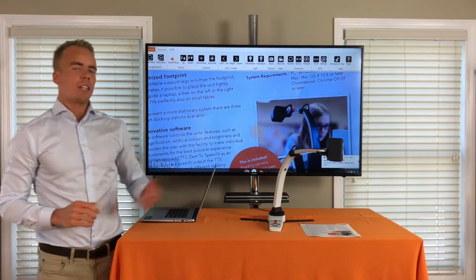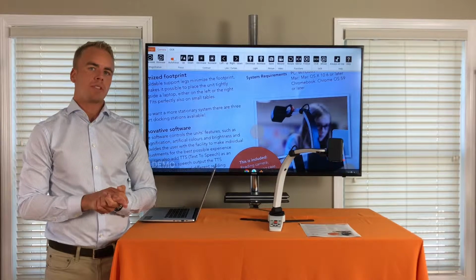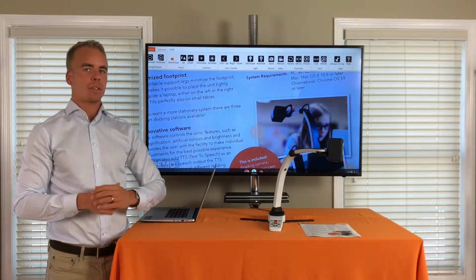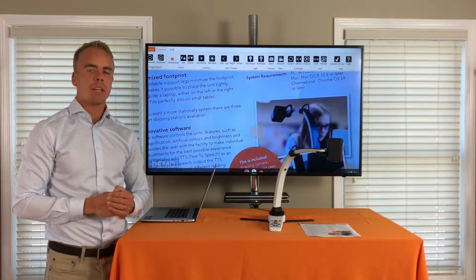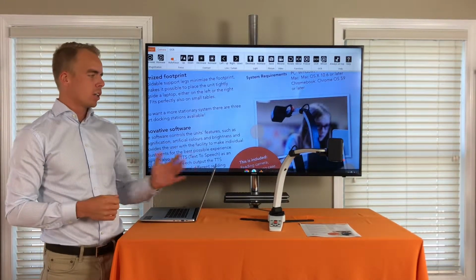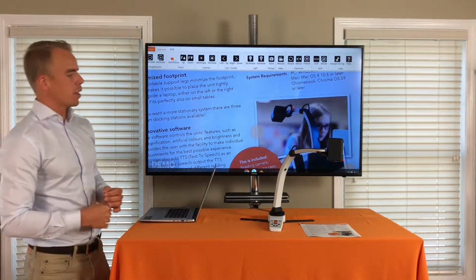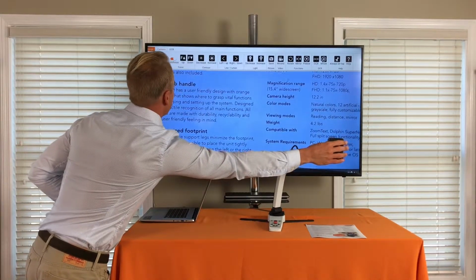The first time I'm connecting this device into my Chromebook, I need to go to the Google Web Store where I search for MagniLink or LVI or Chrome Viewer, and I will find the app, and I simply just download the app into my Chromebook, connect the device, and I'm ready to go. So now you can see we are up and running. I will angle the paper a little more properly here, like that.